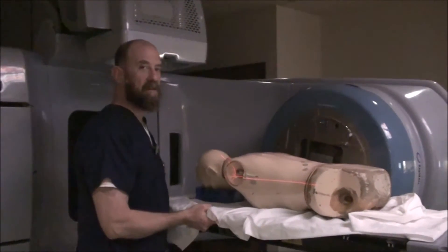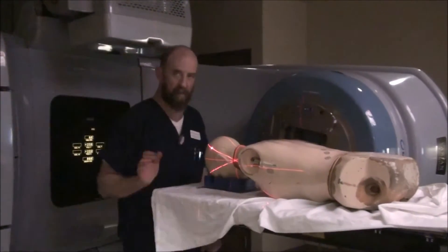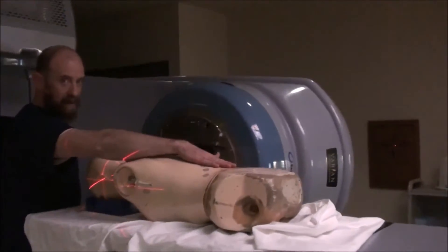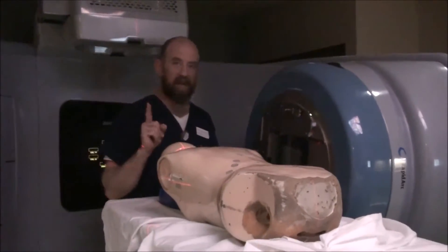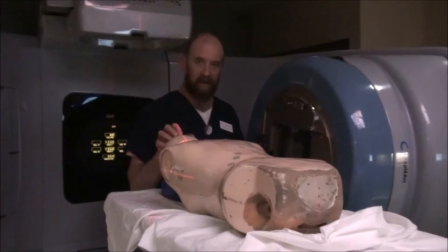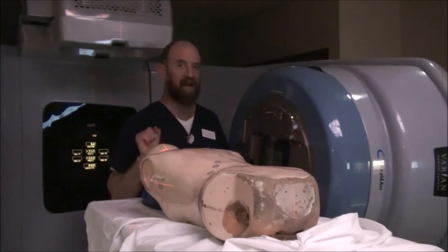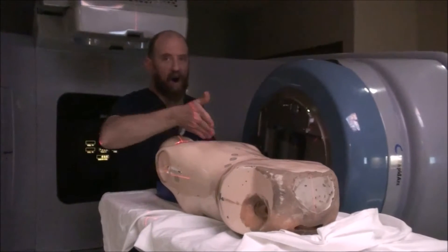Next, you're going to do more ballparking. None of this is even aligning to anything except for ballparking. You want to get all of your posterior marks from the head all the way to the butt in line with each other. You've got to do this first because after you treat the cranial field, you can't move the patient again. If you treat the cranial field and then discover that they're crooked, you're screwed. Get the patient perfectly straight all the way through.